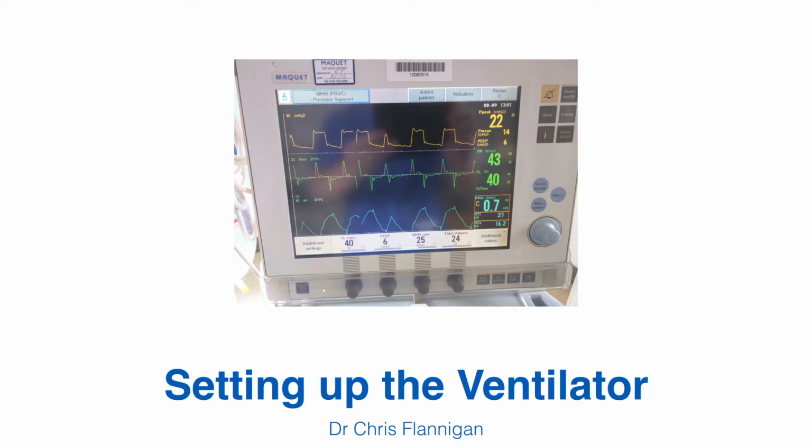Okay, and the last thing we need to tell the ventilator is how much gas to blow into the patient with each breath, and this is the tidal volume. If you're using a volume mode of ventilation, you'll set a tidal volume for each breath. If you're using a pressure mode of ventilation, you'll just select a peak pressure that you want the ventilator to blow to for the duration of the inspiratory time, and then whatever volume that delivers will depend on the compliance of the lungs.